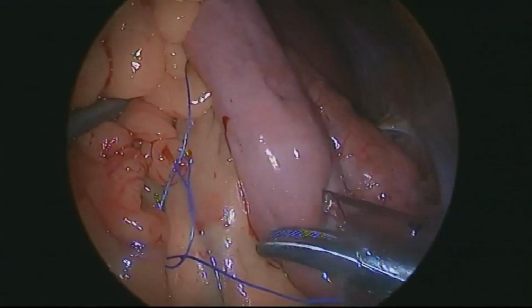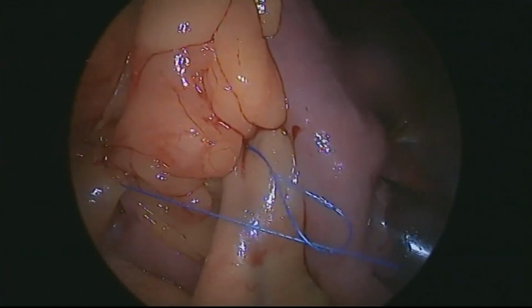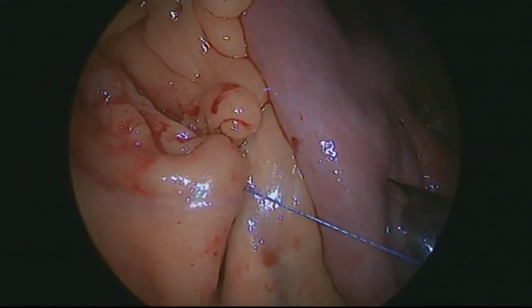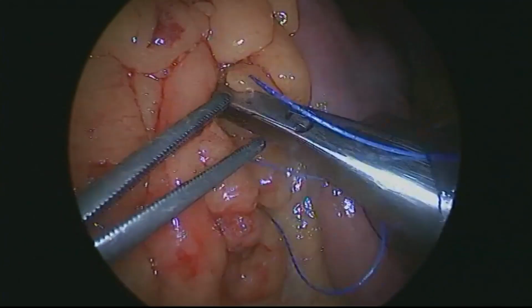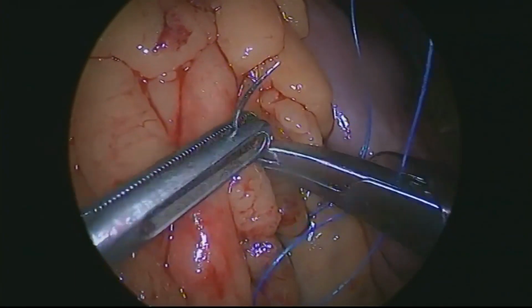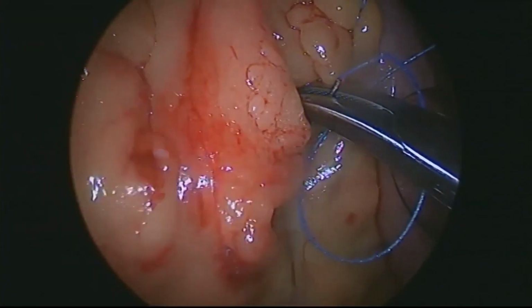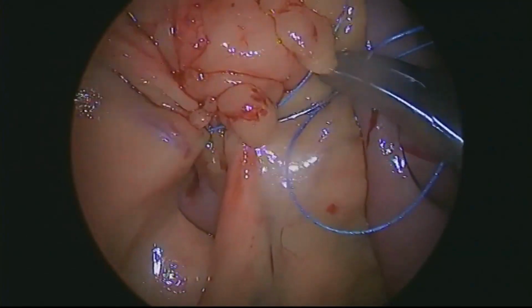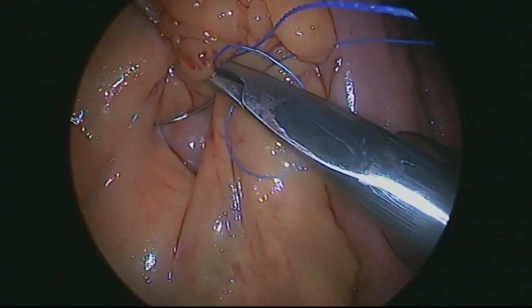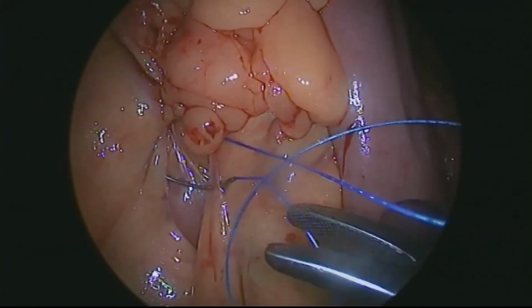We tighten the stitch, making sure that we don't include fatty tissue, because the fatty tissue will melt, since the patient will obviously lose weight, and then the place where the fatty tissue is present will result in a defect that may, on its part, cause an internal hernia.